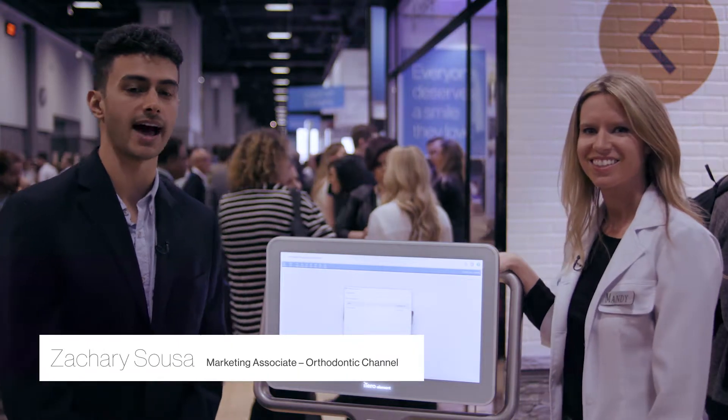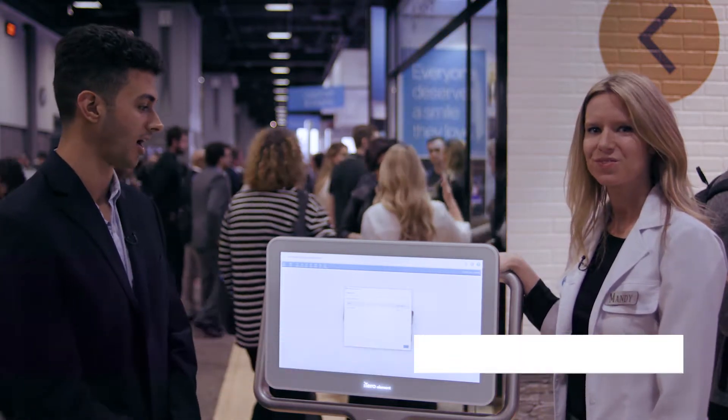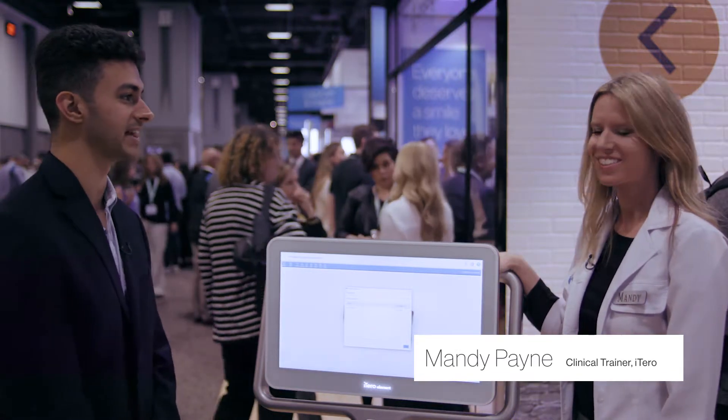Hey everyone, we're here at AAO and I have Mandy Payne to walk us through the progress assessment tool on the iTero Element 2 scanner. Mandy, you want to show us how it works?